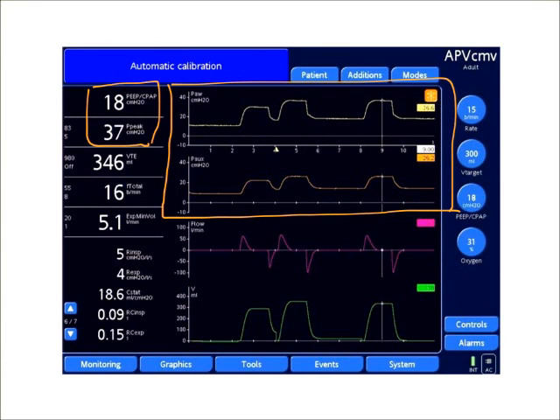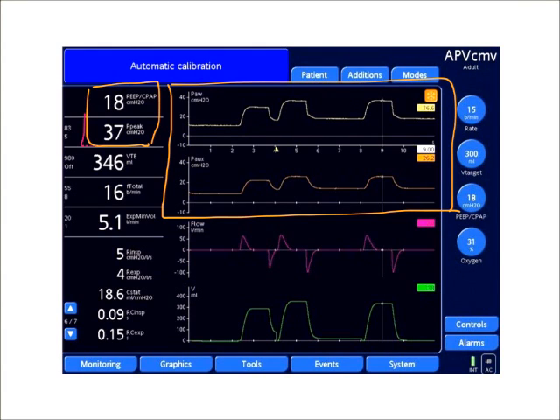As you notice, I have a peak pressure of 37. I'm just going to highlight that again in red. On the left hand portion of the screen, I have a peak pressure of 37 centimeters of water, and my PEEP is set at 18.